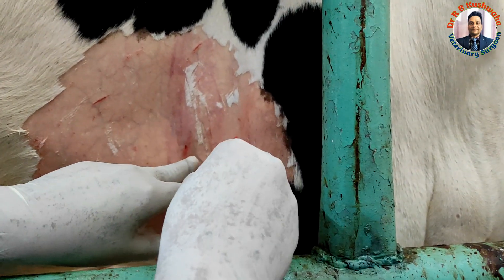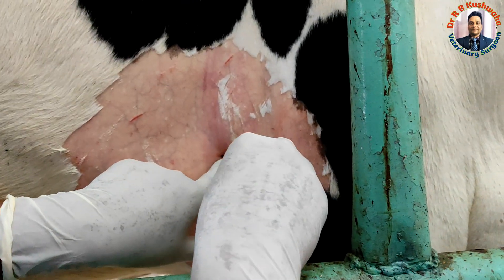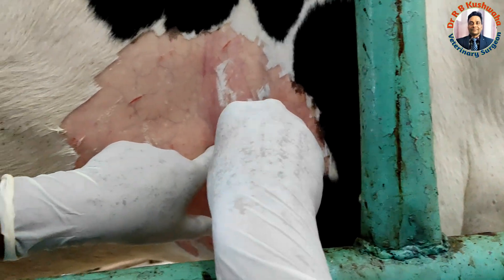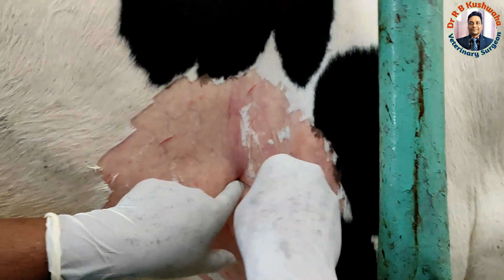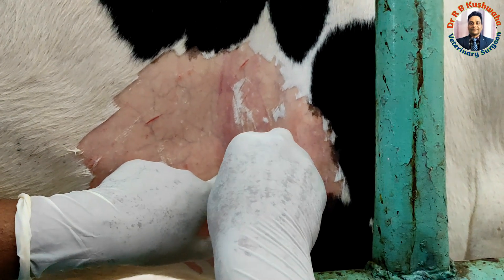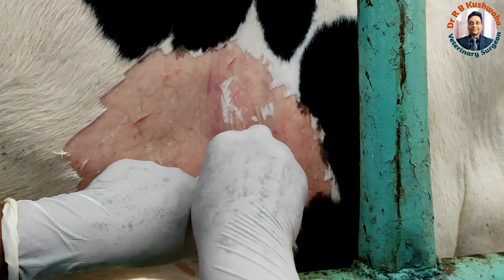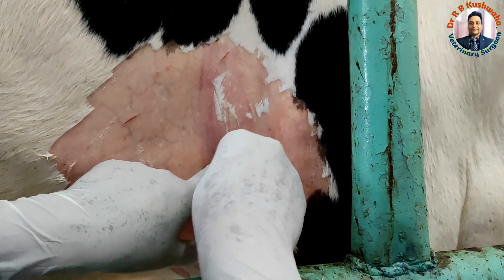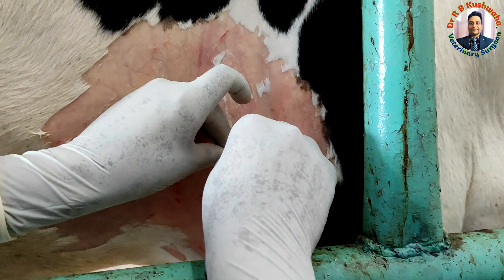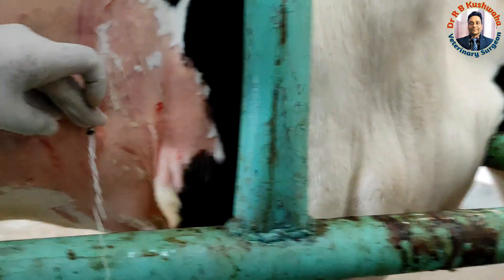We insert the needle from here — this is the 5th intercostal space on the right side. We insert slowly and gently. Now you could see it has gone in, and now you can see the flow of fluid.